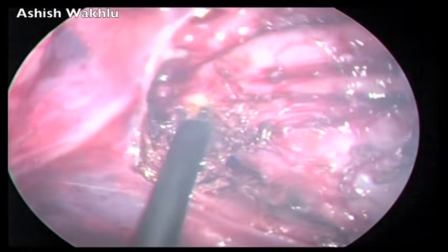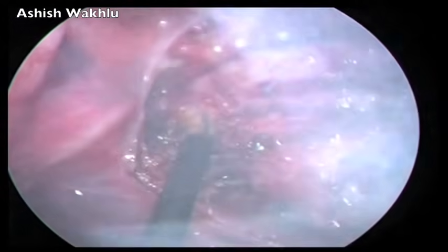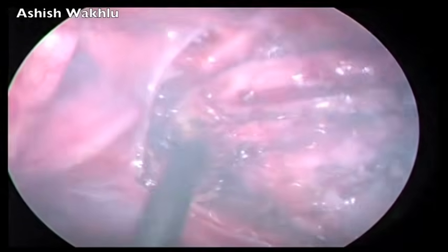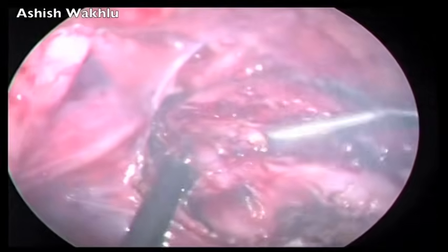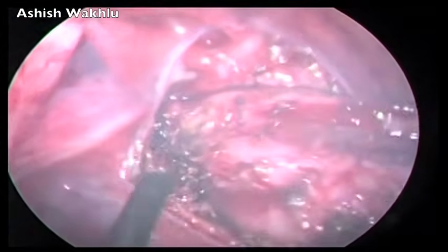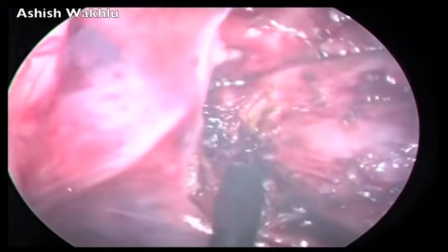So we continue the dissection on the ventral aspect of the fistula, staying very close to the rectal wall at this point because all the structures like the ureter and the vasa deferentia seem to converge towards each other at this level.